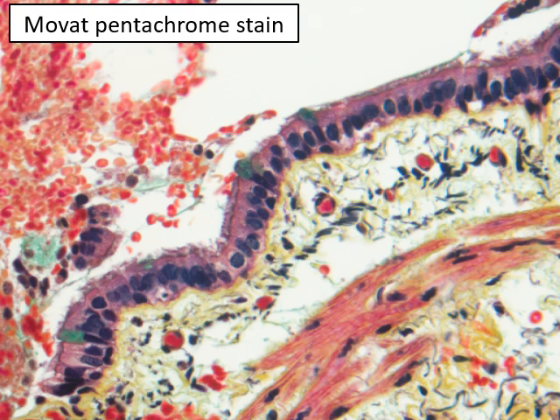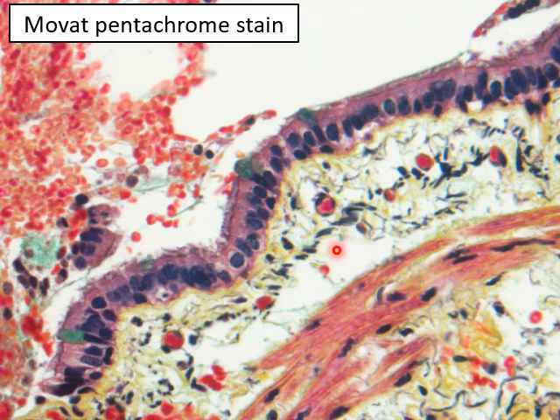A Movat pentachrome stain uses five different colors. One useful feature is that it stains mucin green, making goblet cells stand out clearly. It also shows capillaries in the mucosa, and highlights elastic tissue as black structures — elastic tissue is very difficult to see on H&E but is revealed by Movat pentachrome or Verhoeff–van Gieson stains. The supporting material in the mucosa consists of yellow collagen and black elastin.